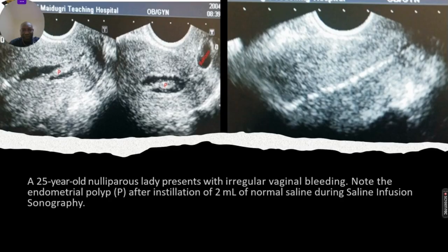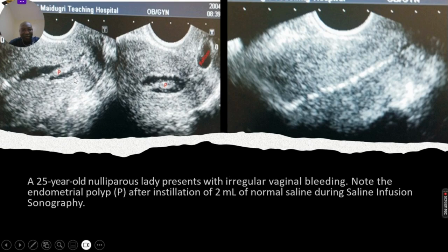Now let's look at polyps. This was a 25-year-old who presented with intermenstrual bleeding. After installation of saline, note the polyp here with its stalk. This will guide the hysteroscopy when taking a biopsy or doing a polypectomy — you can actually measure the length of the stalk and the polyp. After the procedure, look at the air within the endometrial cavity.